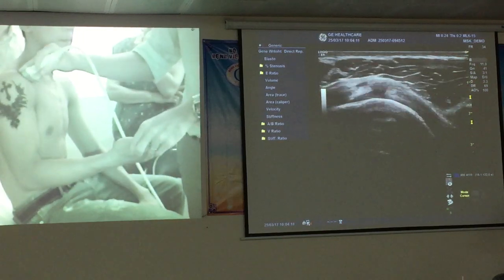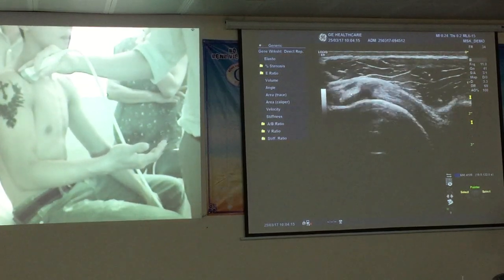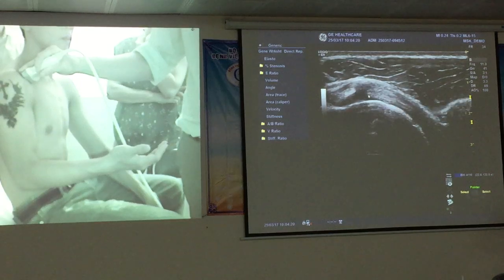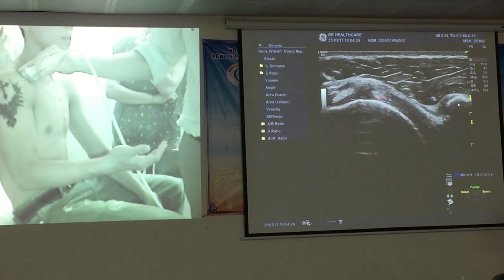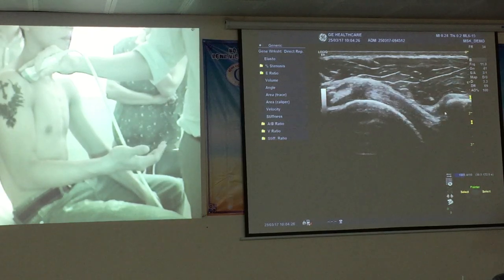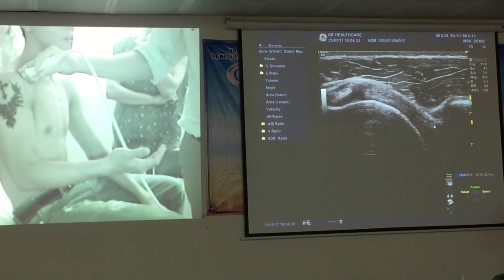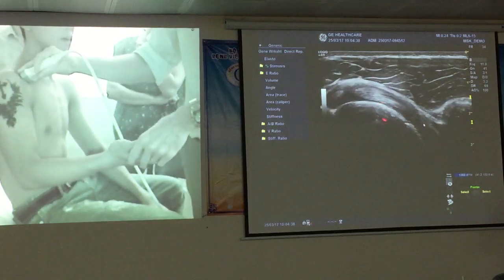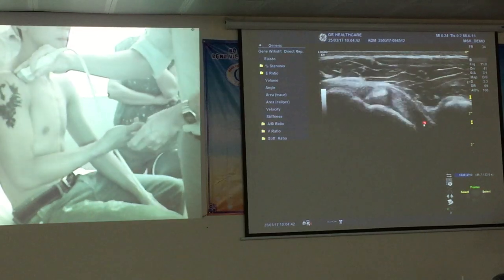So we have a look at the subscapularis. Bây giờ mình khảo sát cái gân dưới vai. So once again, using our long head of biceps as our main landmark. Mình sử dụng cái đầu dài cơ nhị đầu cánh tay là cái điểm mốc để căn cứ ở phía trước của nó là dưới vai. This is our coracoid process. So this is the subscapularis tendon coming up from beneath the coracoid. Mình thấy mốc xương là làm căn cứ là đây là mỏm quạ, đây là chỏm xương cánh tay, thì cái gân cơ mà ở dưới chỗ mỏm quạ này sẽ là dưới vai.